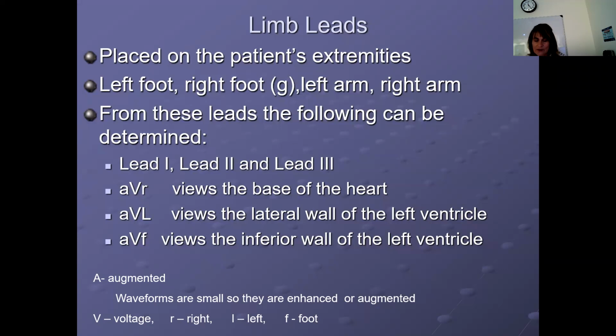So when they're in the chair, putting it on the ankle is not going to work, I guess. It depends on what they're wearing. Sometimes I'll try to put it on a hoodie, maybe on the belt, away from the phone. We usually go inside the calves for the lower limb leads. Avoid the bones.